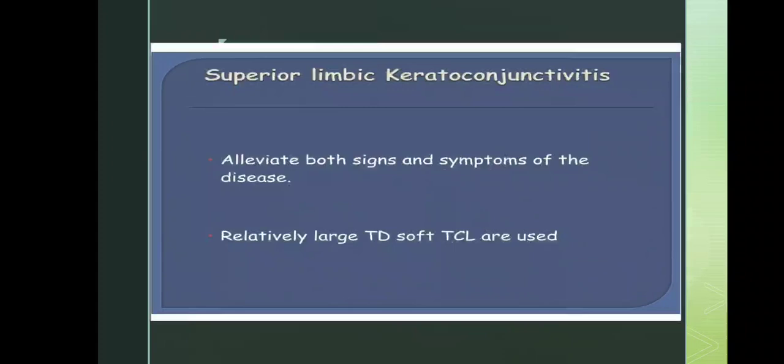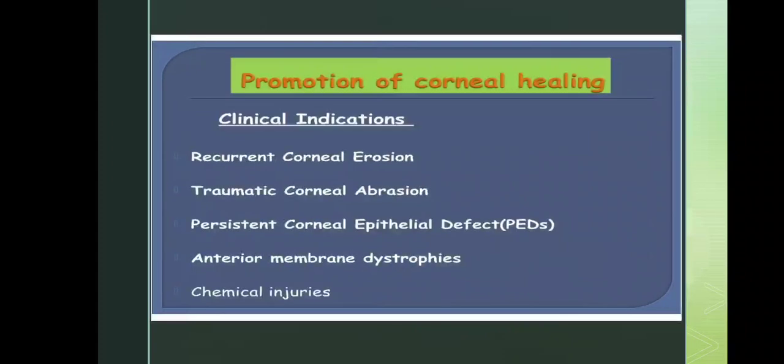The next one is superior limbic keratoconjunctivitis. It alleviates both the signs and symptoms of the disease. Relatively large therapeutic TD soft contact lenses are used. It promotes corneal healing.